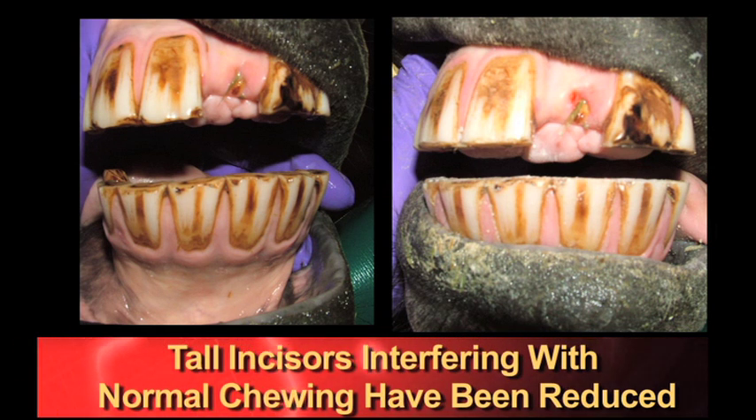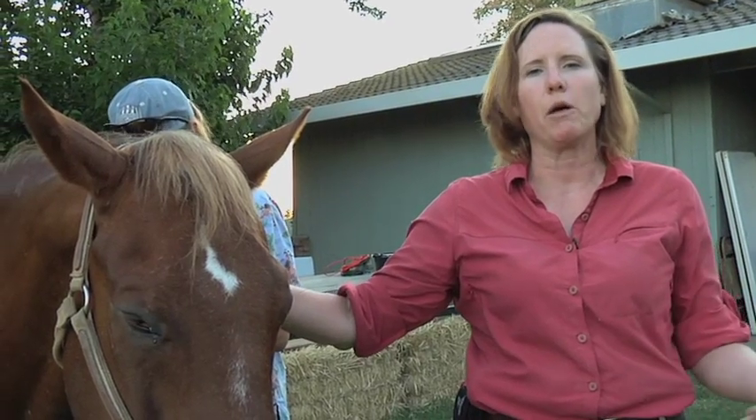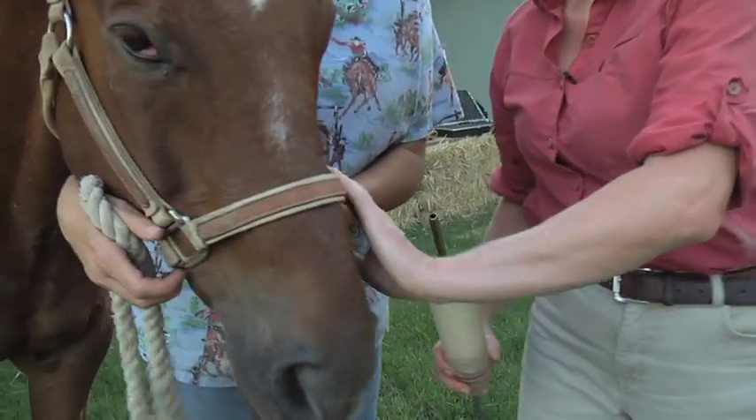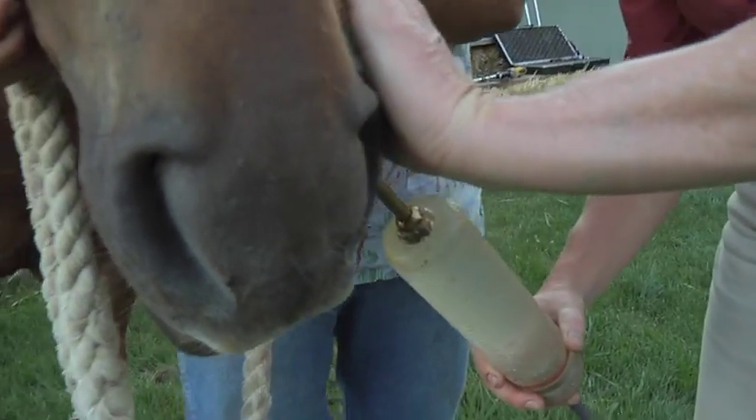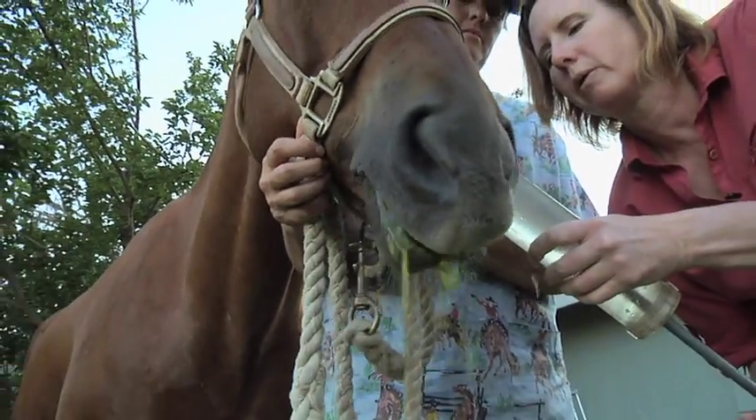So Scooter has been sedated. I'm going to go ahead and begin by flushing out his mouth. I want to rinse out any feed that he may have stored in there so I can actually get a good look at his teeth. This also allows me to evaluate his level of sedation — if he doesn't tolerate this, he's not going to tolerate anything else.